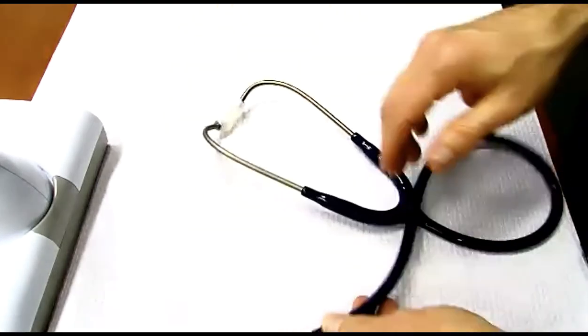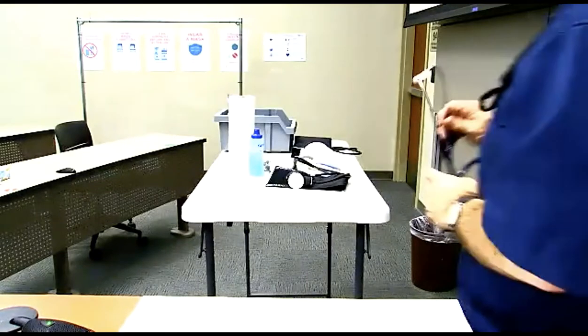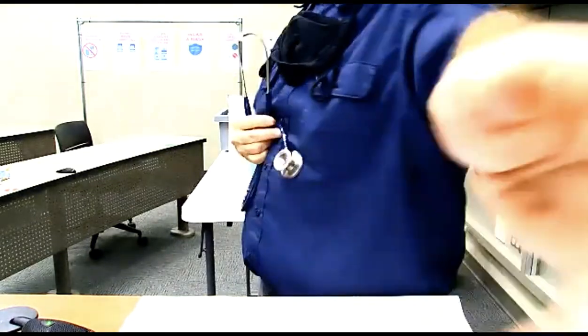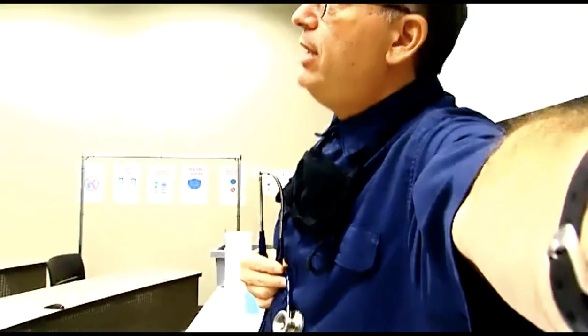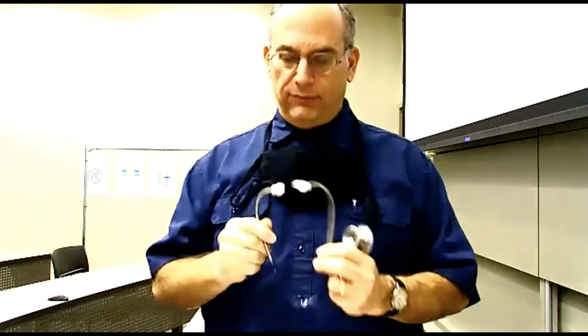Okay, so last thing, that's really all I've got to say, but I'm telling you, the number one problem we have is students saying, I can't hear anything from the stethoscope. So when you go to use your stethoscope, the first thing you do before you put it on, look here to make sure it's angled towards the nose. So first step, look and make sure it's angled correctly. Secondly, look at the dot.